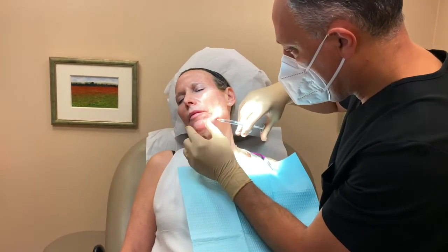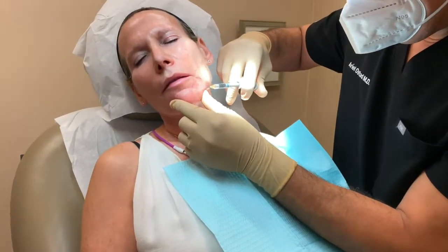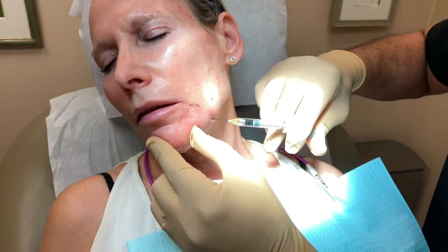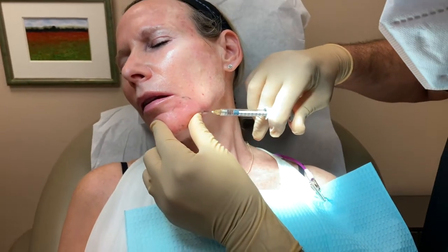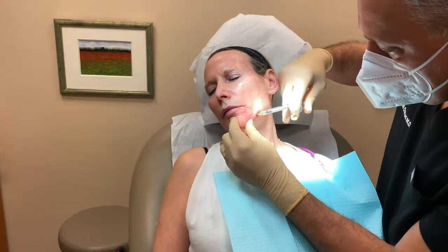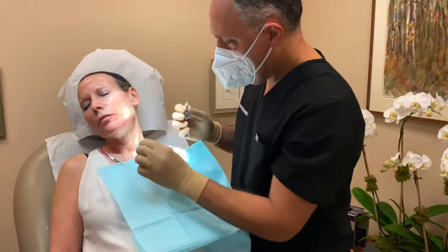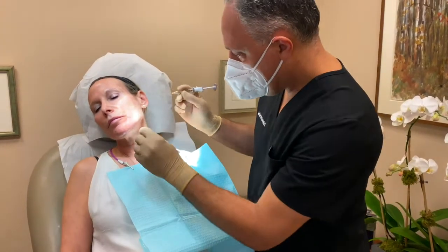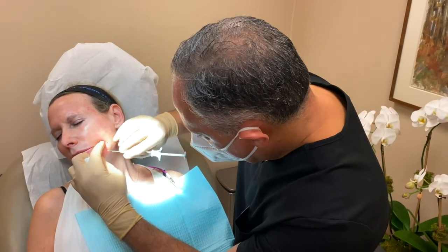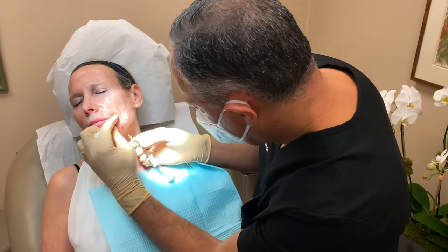If you need a break at any point, let me know. So again, we apply a customized approach to each and every patient depending on where their needs are. And I'm just right below the skin. I'm not deep at all. It was 1/2 syringe. Very important to follow a sterile injection technique.